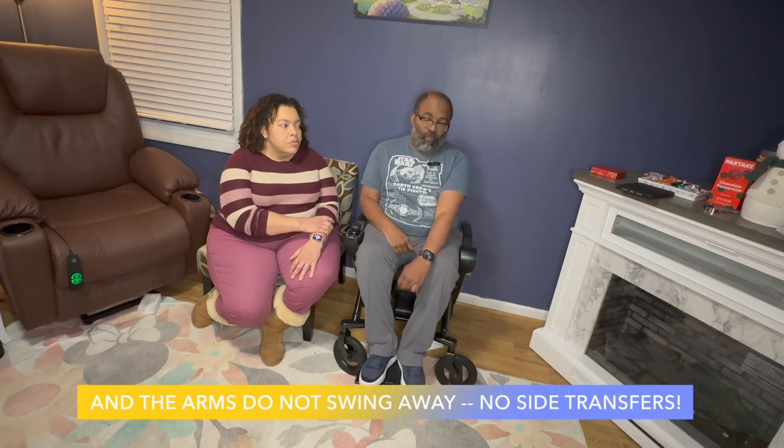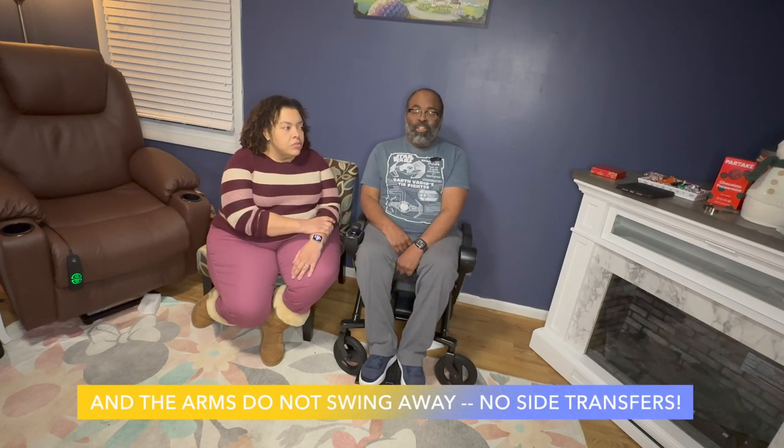Some things are a little different for me. The footrest — for me to stand, I need to be right under it, and this footrest is in the way somewhat. I'm going to need a little more adjusting to get out of this chair when I do my transfers. Because it's a very lightweight, portable model, you don't have that many back adjustable options. On the other model, I can adjust the angle to make it better suited for my back. The cushion is much thinner than my normal cushion, and since we sit on our chairs all day, we have to be comfortable. I put my old cushion on here and it felt better. This would only probably work for quick trips — for my personal experience, this could not be my full-time mobility device.